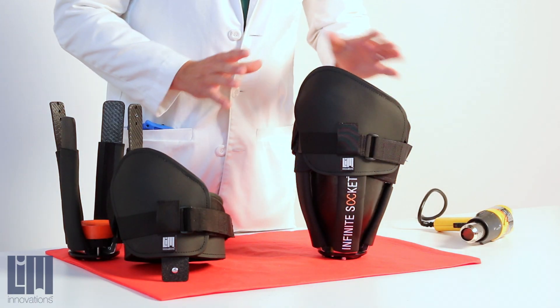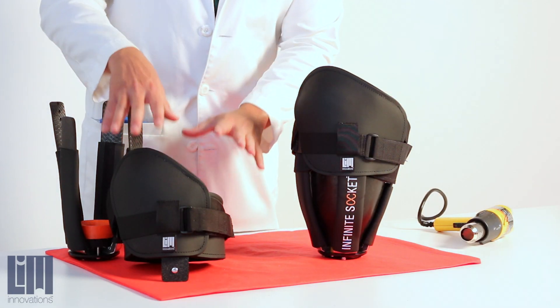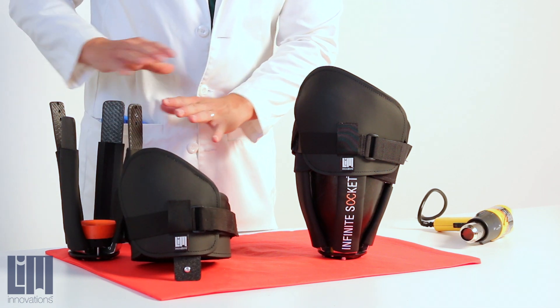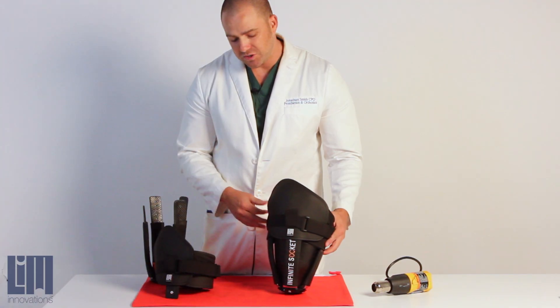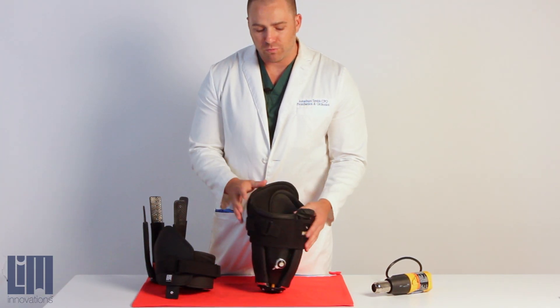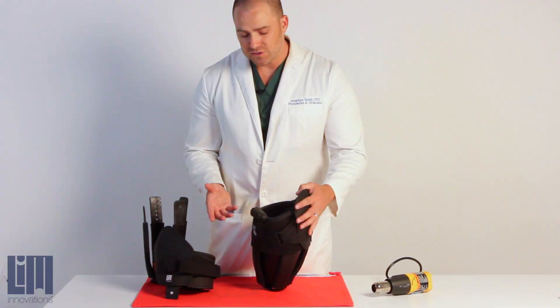There are two ways you can go about it. One, you can remove the brim from your struts as we've done over here. Or two, have the patient take the socket off and leave it on top of the struts. Of course, it depends on which portion of the brim you're going to heat.